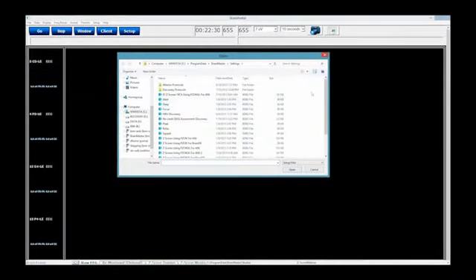Now, you're going to notice if you have the BrainAvatar 4.4.1 software, there were a lot of changes that we've initialized into them, and I've covered some of those in the What's New in the BrainAvatar 4.4.1 webinar, which should be going online here shortly. I'm going to go over those a little bit more too, and some of the ones actually that I didn't cover on it.